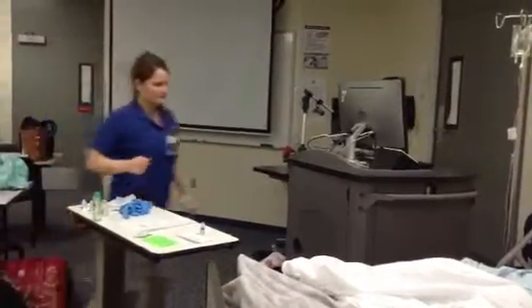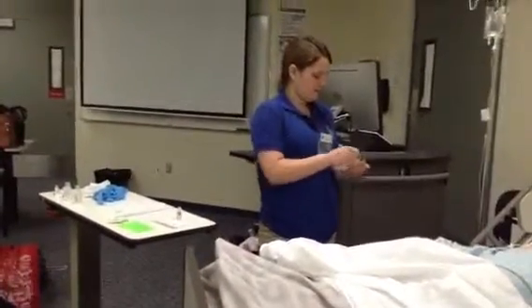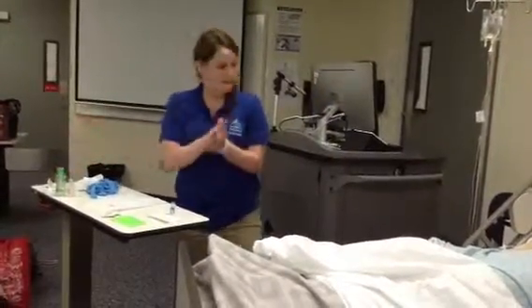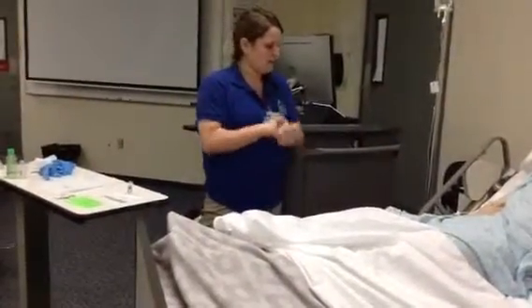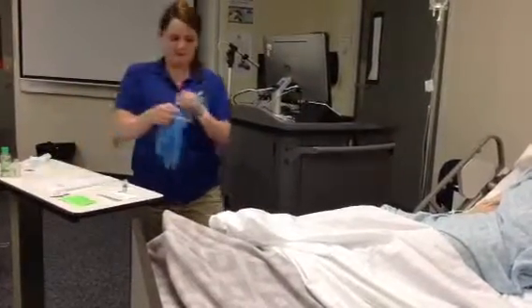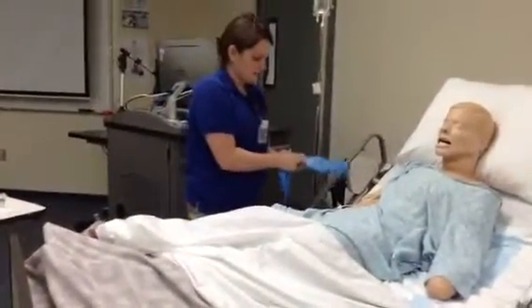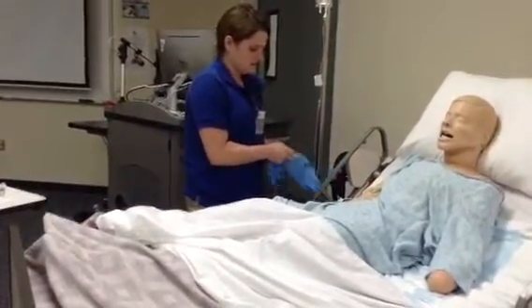Knock, knock, knock. Hi, Mr. Jackson, how you doing? I see that all your medication is ran through. How are you feeling? How's that IV feel? Good, I'm going to check the patency of the IV, make sure there's no phlebitis or infiltration. It looks good, I don't see anything.